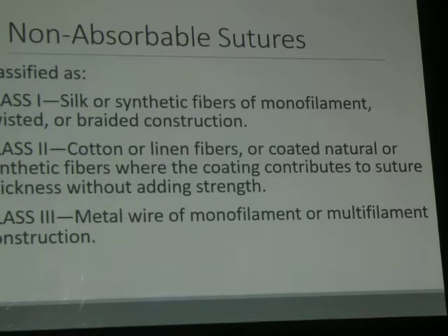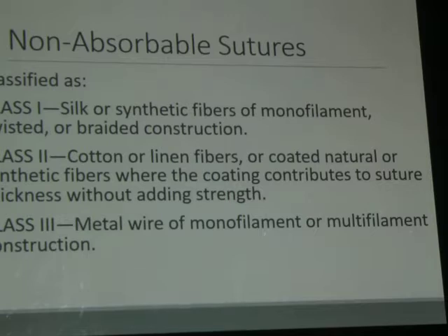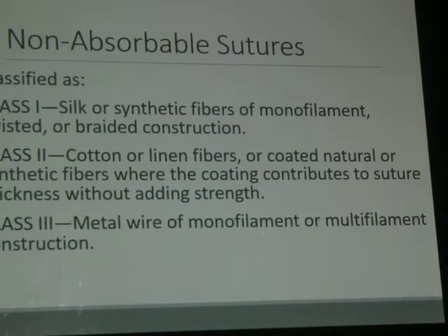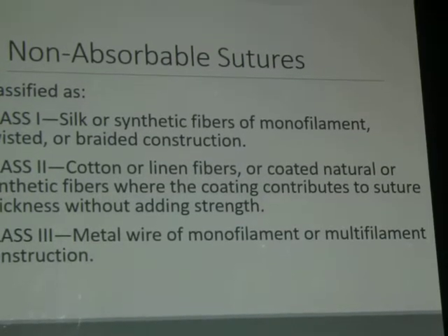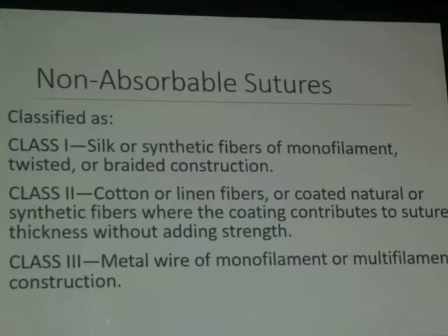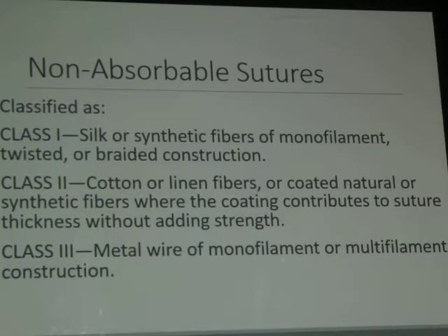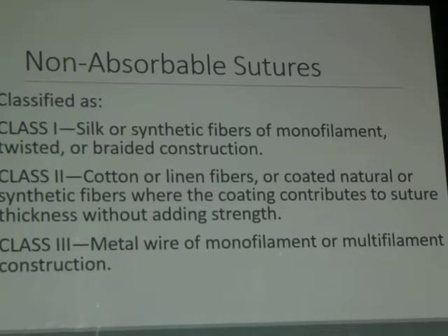Non-absorbable sutures are very common sutures, and actually the gold standard of non-absorbable sutures is silk. احنا أظن كلنا بتوع لوز حرير، الحرير ده is the gold standard of non-absorbable sutures, and actually this is the commonest used non-absorbable suture so far because it is available in different colors, different strengths, and different coating material as well.